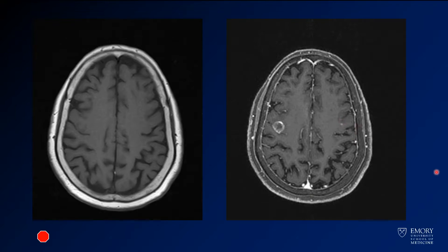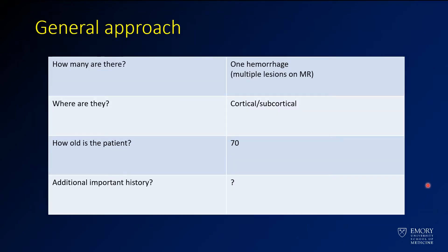You also want to look — maybe there's a little bit of enhancement over on the other side. So when we look at this, we see one hemorrhage, but on MR we're seeing other lesions. The location is cortical or subcortical. This patient is 70 years old. We don't really know additional history about this person, but the things we want to think about: do they have a history of malignancy? Were they hypertensive? Are they septic? What other things do we have going on?